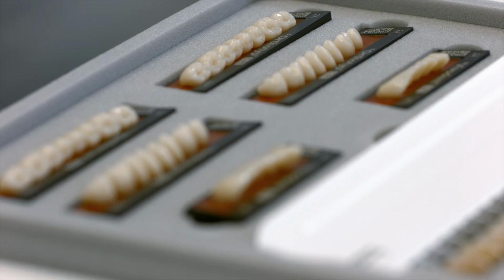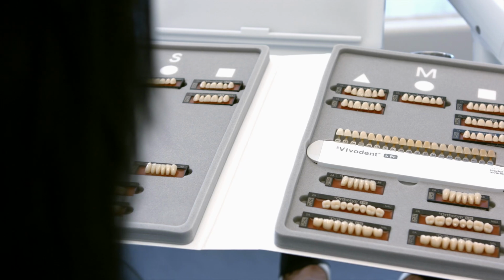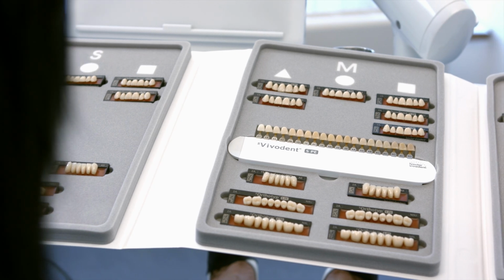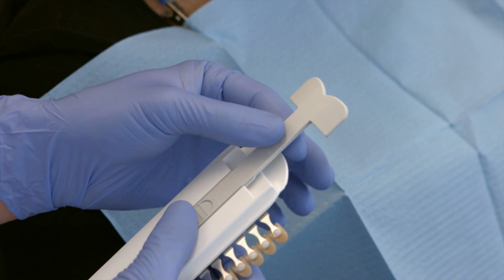The tooth mold chart also assists you in selecting the appropriate size of posterior molds to match the anterior ones. This range of choice enables you to consider and meet the functional and aesthetic needs of your patient. Use the papillometer to determine the length of the upper lip and the lip closure line.